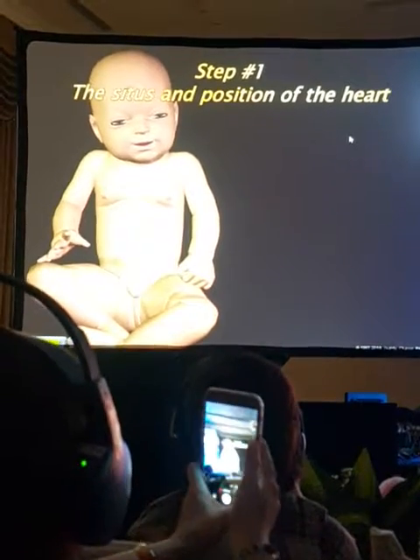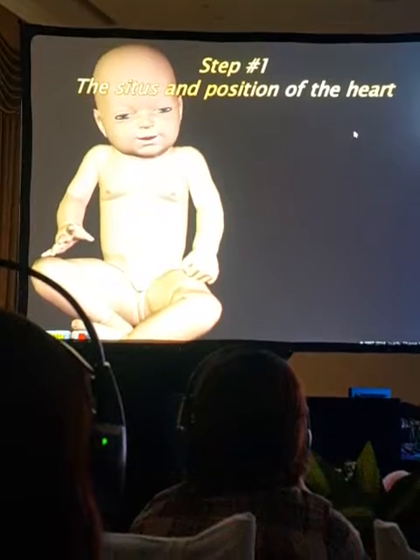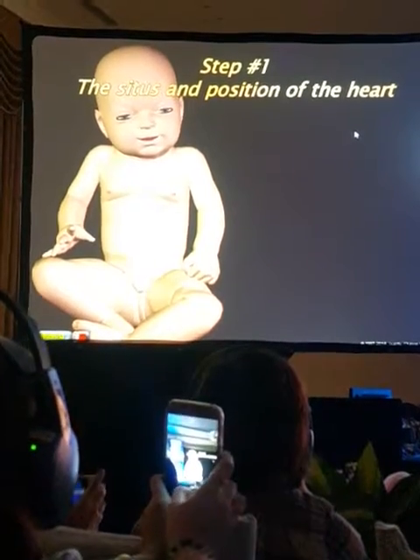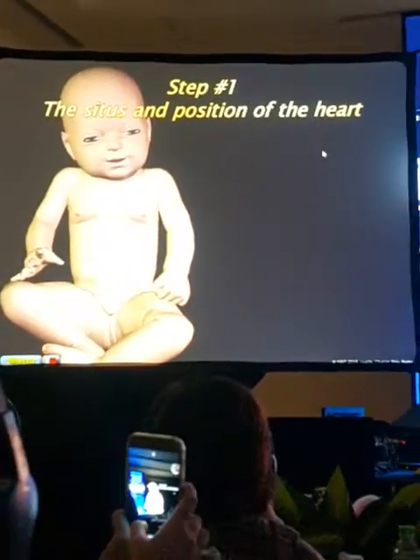So now you know how to do the chambers, you know how to get the views, you know how to perform the exam, but what is the mental process? You have this baby that arrives with you and someone says, funny looking heart, please investigate. What is the first thing we have to do?